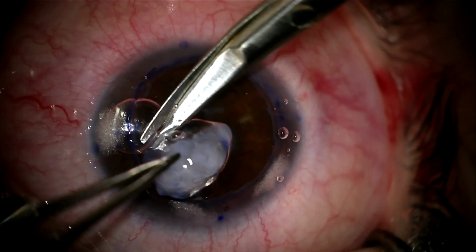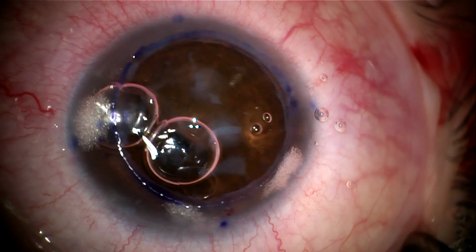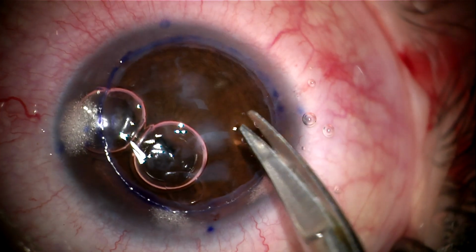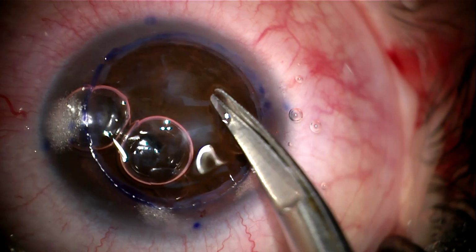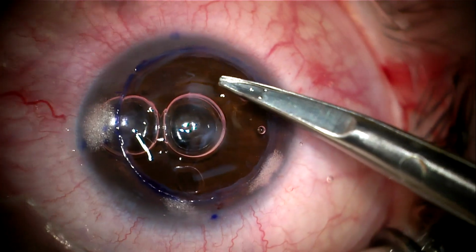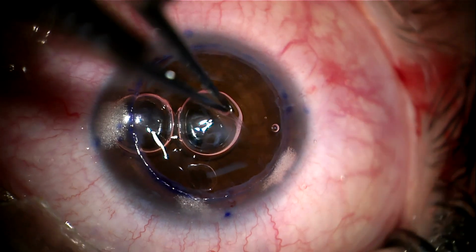So our aim is to bare the central 3 to 4 mm only, cutting the scarred predescemetic layer by small snips of a blunt corneal scissors, forming a central window in the predescemetic layer.